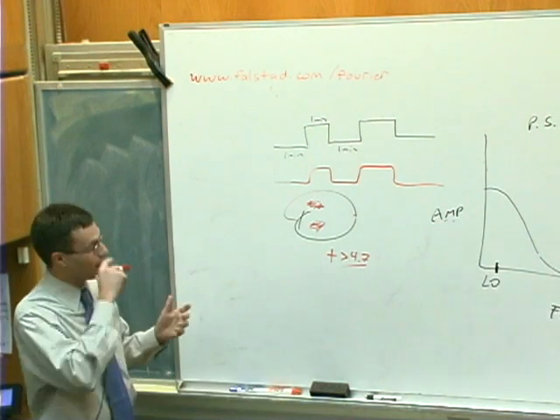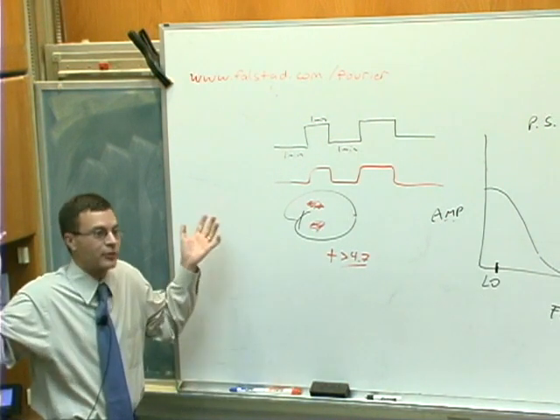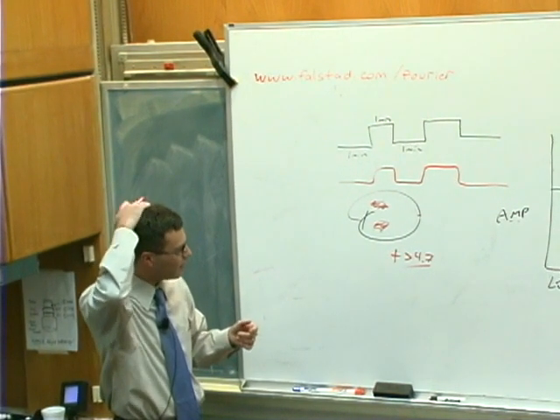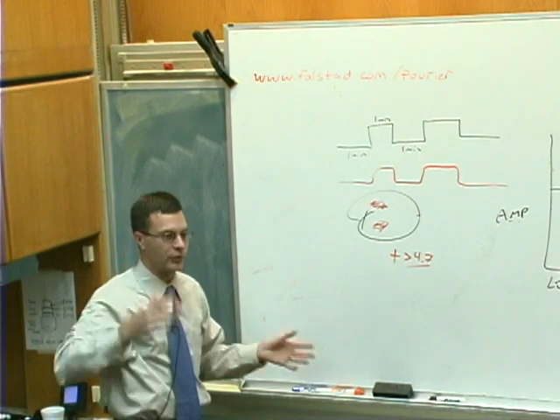So in any event, there was no stimuli whatsoever. The subject just sat in the dark for the whole hour worth of scanning. So what the hell happened? How come I have all these significant blobs, even though the subjects did nothing?